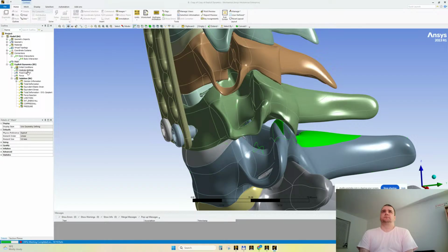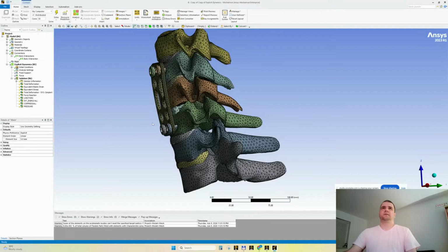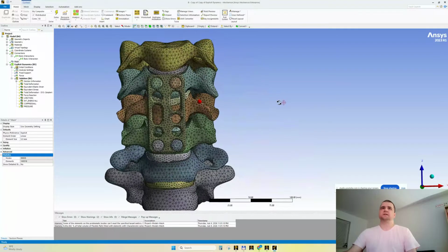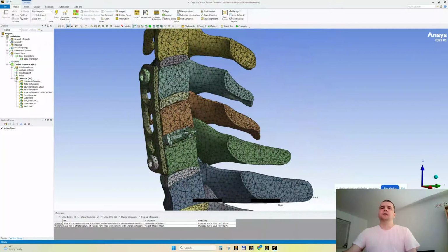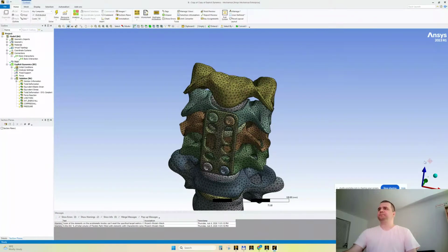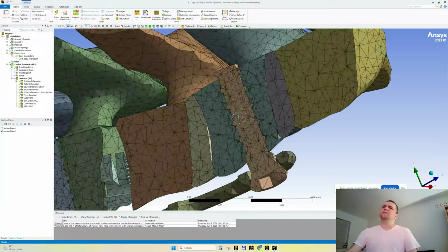This is the make or break moment. Nevertheless, if there are problems, we will solve them, but it will extend the time. So look here. We're blessed. We're very blessed. Just for fun, how many nodes? 37,000 nodes. It looks so nice. Let's make some section views. We do have something in the middle, which looks like this. And I would like also to have an additional section between the screws, just to contemplate the screws. Oh my God, they look so nice.